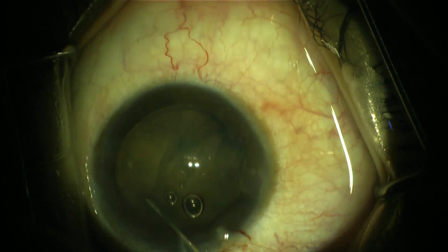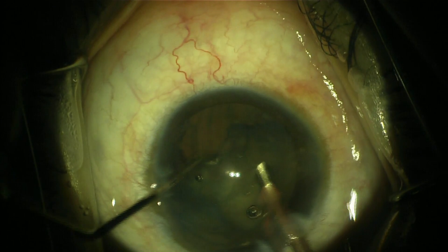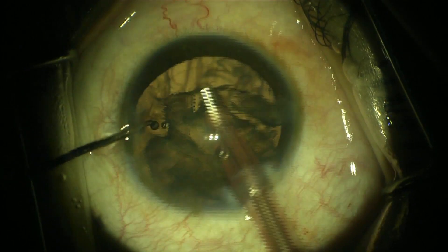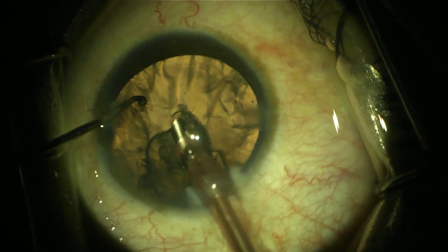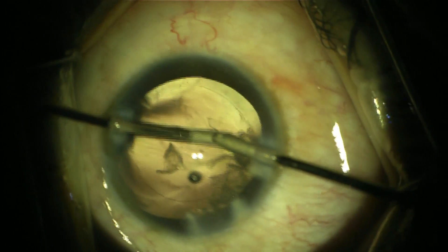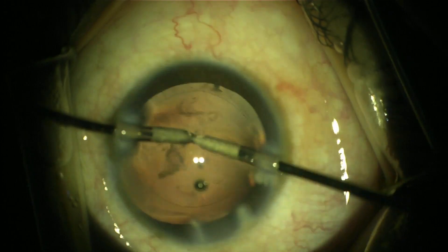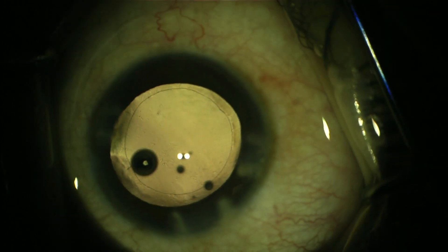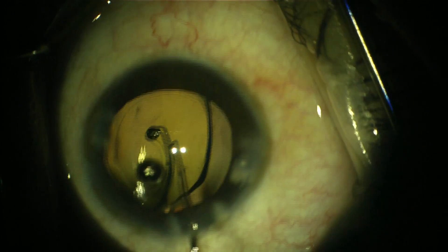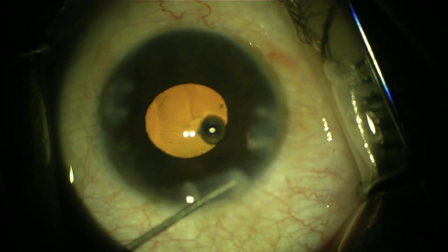The cataract in this case was soft, so it was easy to remove. The patient was a high myope, and a plus eight IOL was implanted in the bag. Finally, I washed out the viscoelastic and performed hydration of the incisions.